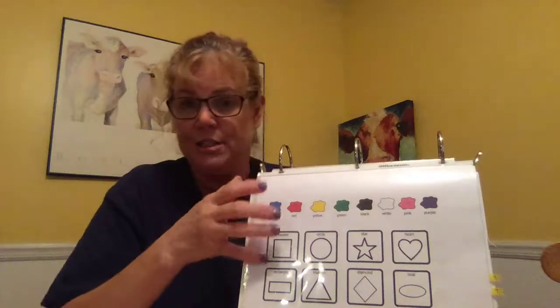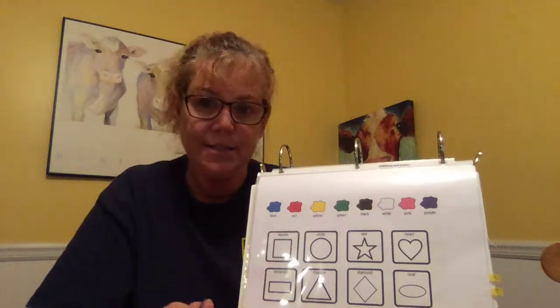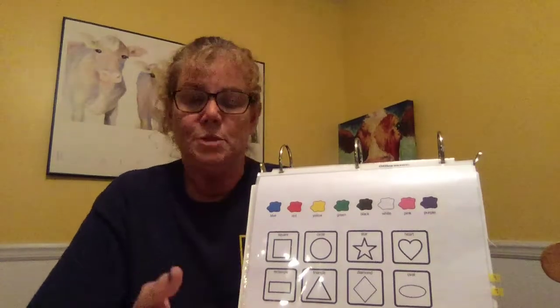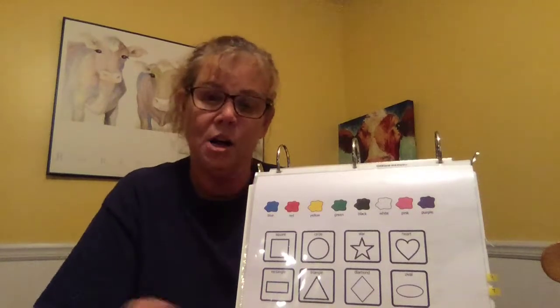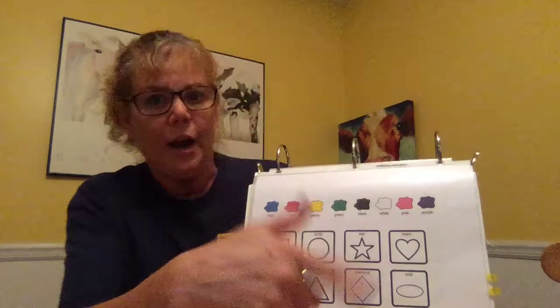So the pages in here, the teacher can go in and put in pages that will be used for lessons that day. So she can take it out, she can take it in. She might want to leave a page that has general math vocabulary in it for him as well. So there can be several pages in this section. But I chose to do this.